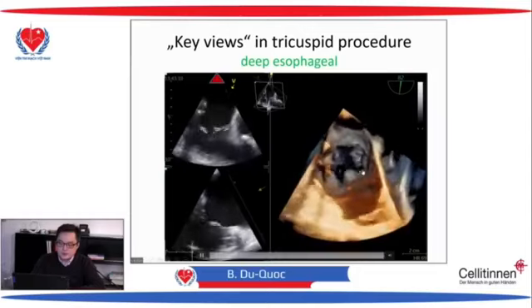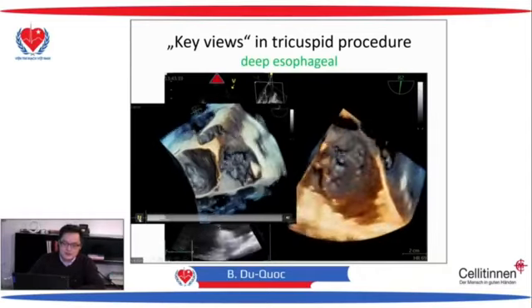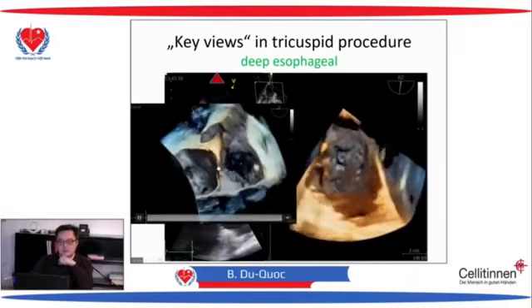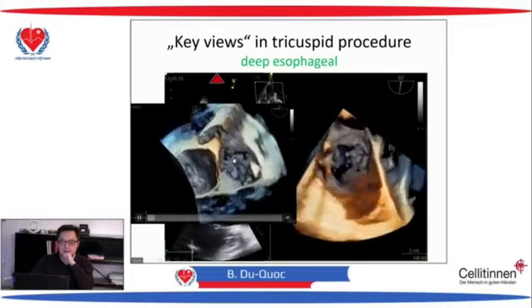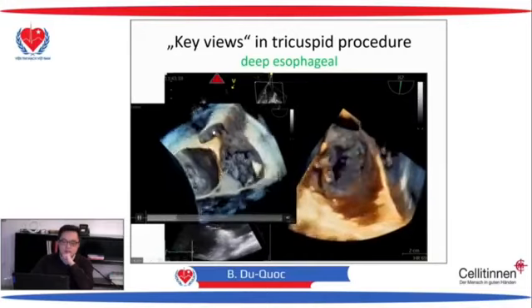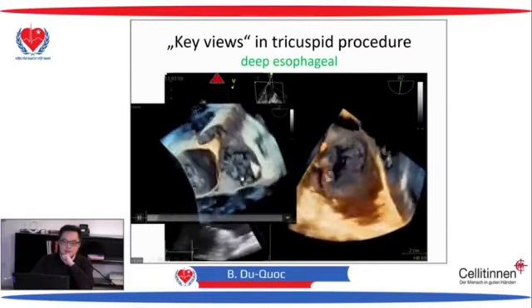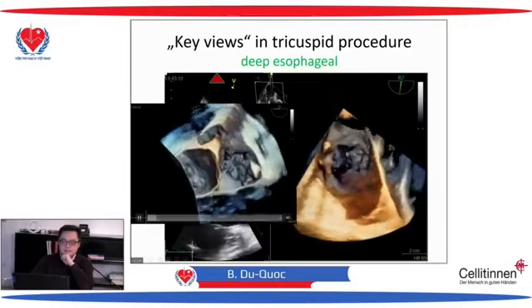If you don't trust me, I can give you an overall view of this same thing in a kind of panorama for the zoom. And here is our mitral valve after clipping, and this is the tricuspid. Here is the aortic valve at 11 o'clock, and so you see here the septal leaflet with these leads going through the posterior-septal commissure, like in this picture.